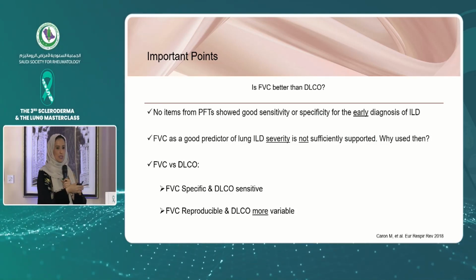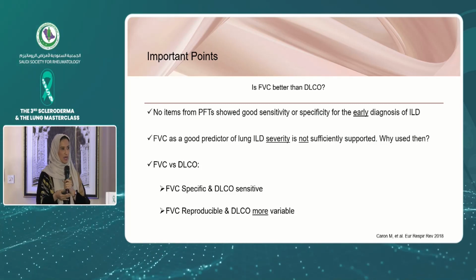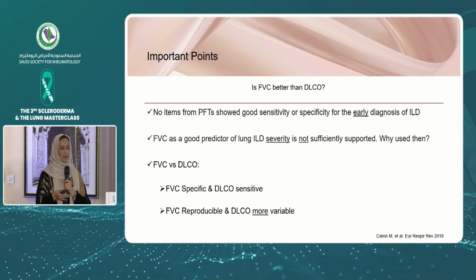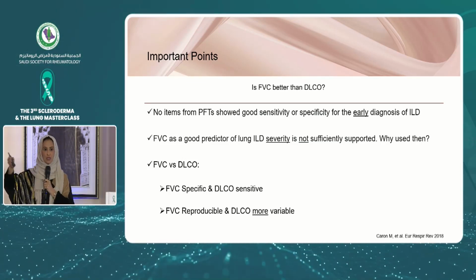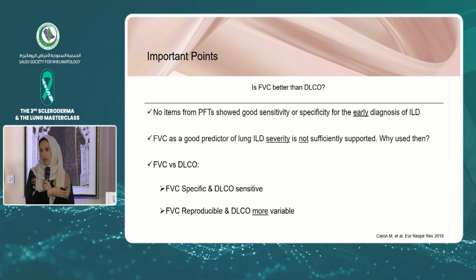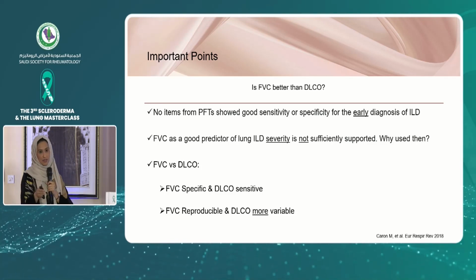The other possibility is that you get a PFT for a patient who had a CT showing an ILD, and the number comes back as 90% of FVC. Is that important? Actually, no, because you don't know the patient's baseline. We know the baseline is a spectrum between 80% and 120%. What if the patient's FVC had been 110 a year or a year and a half ago? Then this is a significant drop from his baseline, which had never been captured by PFT as a baseline.